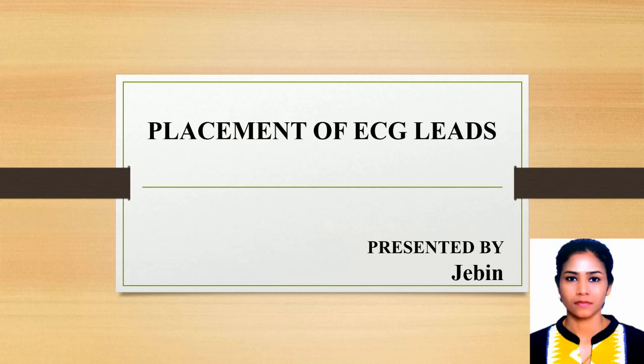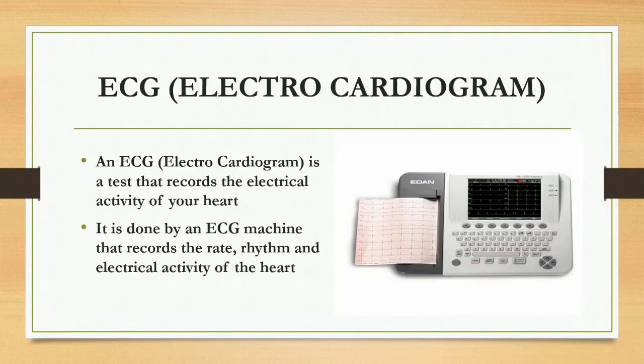Today I am going to discuss the placement of ECG leads. Let's move on to the topic. ECG, electrocardiogram. As you all know, an electrocardiogram is a test that records the electrical activity of your heart. It is done by an ECG machine that records the rate, rhythm and electrical activity of the heart.